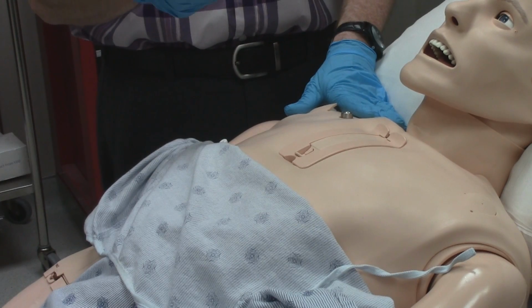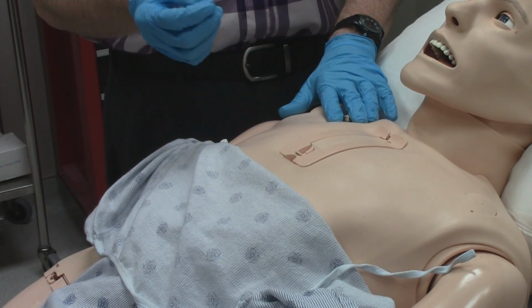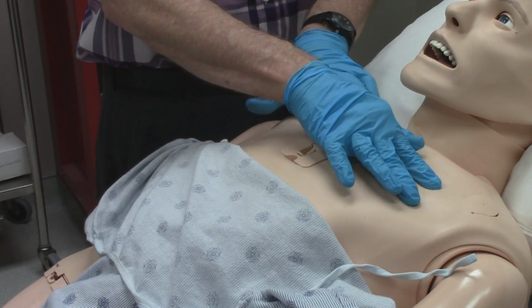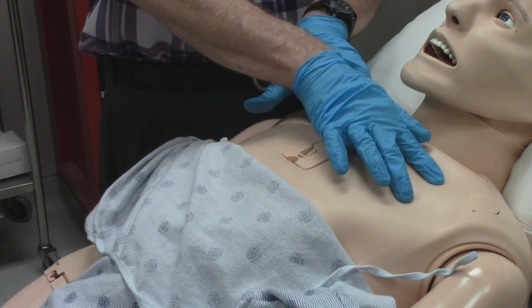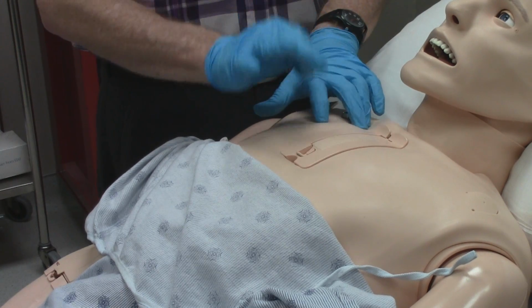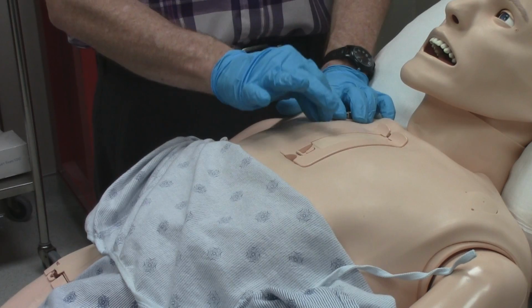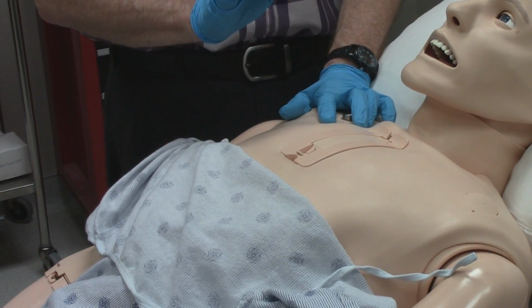If you think the patient is developing a tension pneumothorax, you can perform a needle decompression of the chest. There are soft spots on the patient's chest wall to simulate the second and third intercostal spaces. You can place a needle through one of those soft areas, and when you enter the simulated pleural space, air will whistle out of the needle at you.